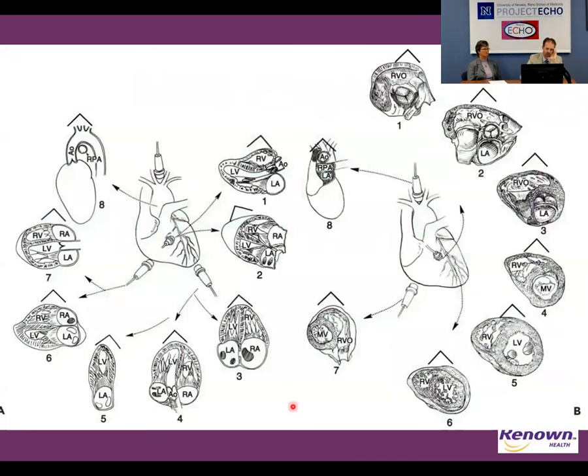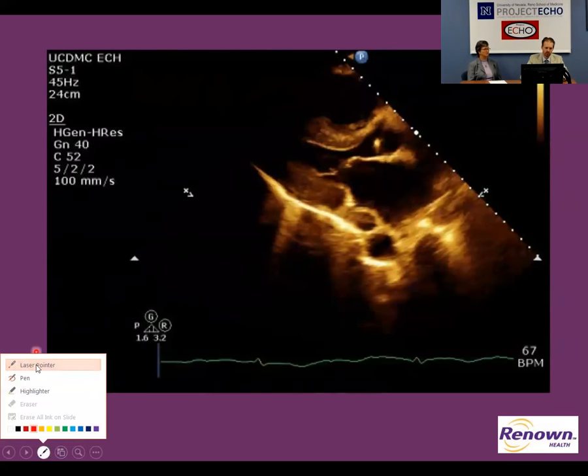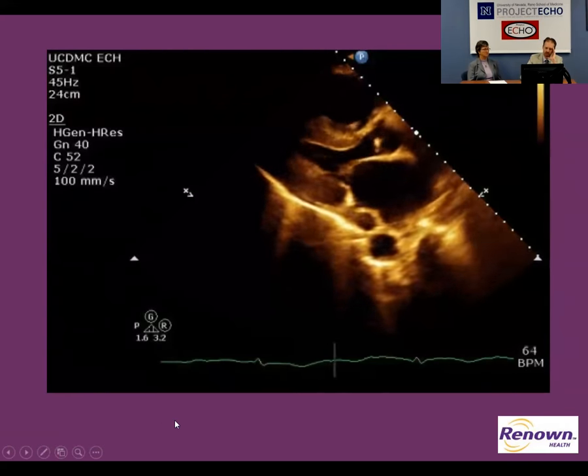So here you go. These are basically different viewing angles in what you're going to see, and we'll go through all of these, but the slide's available for reference and hopefully a useful anatomic correlate to what we're seeing here. Okay, so this is where we typically start.